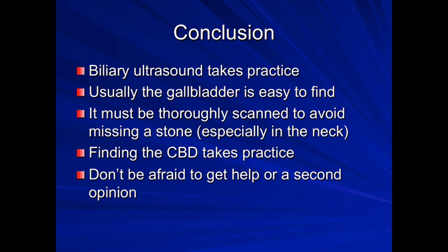Finding the common bile duct takes practice. It's easier if it's enlarged, but it can be particularly difficult in young people where it may only be a couple of millimetres in size. It's also difficult in the obese patient or the patient with a lot of gas where you don't have good ultrasound windows. So I wouldn't expect when you begin that you'll see the CBD every time.